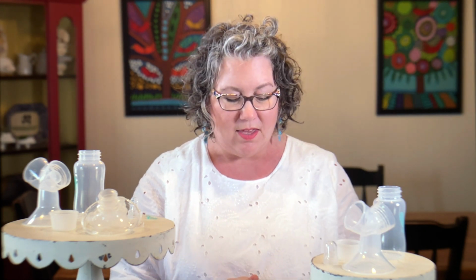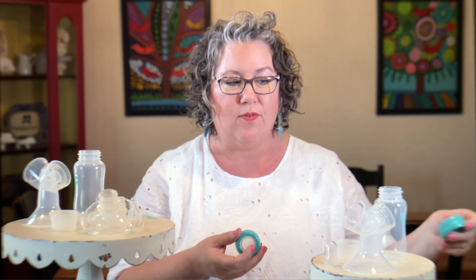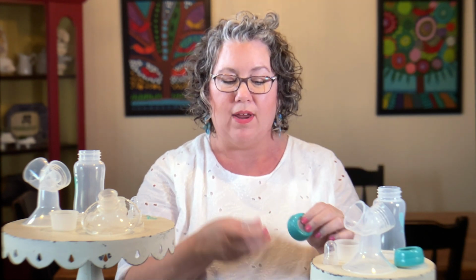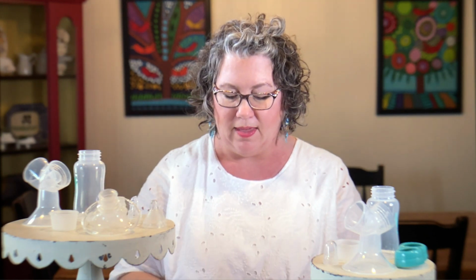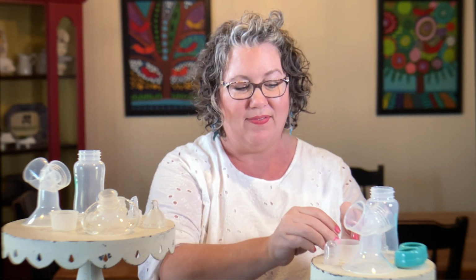There's other parts in your box you'll want to clean also. You will have a little bag that contains lids and sealing discs. This is so you can close off your milk after you pump and store it in the fridge safely. Or you can also use the cap ring with the enclosed nipple in your pump. This way, after you pump your milk, you can actually feed right from the same bottle. So let's go ahead and sanitize the bottle nipple. And you'll have a baggie with more valves and membranes. So go ahead and take everything apart and get them ready for cleaning.